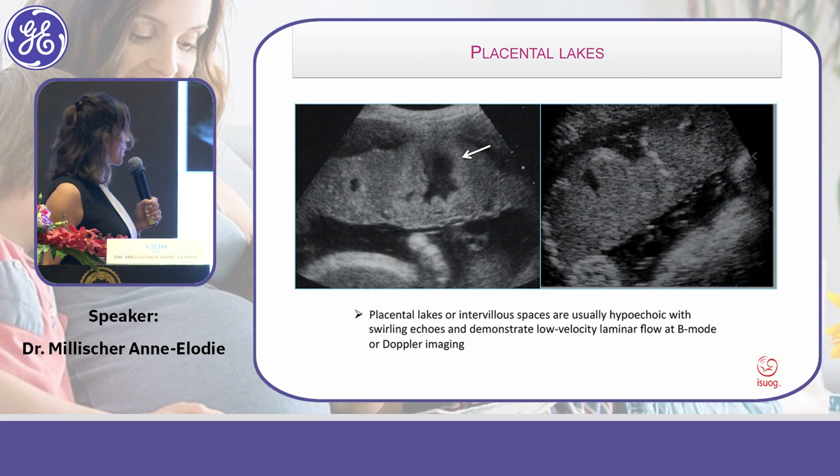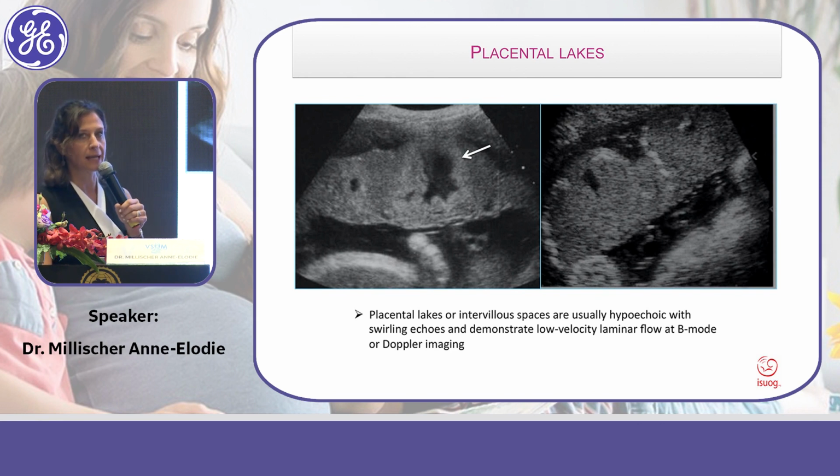We just focus on this normal placental lake just to describe that a normal lacunae like this is surrounded by a hyperechogenic ring, as you can see here, with no Doppler signal inside.